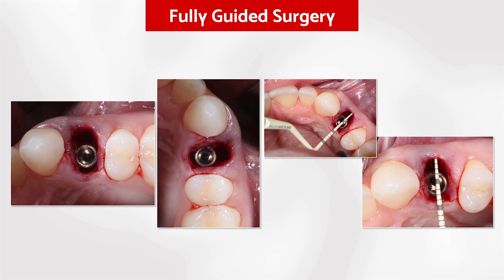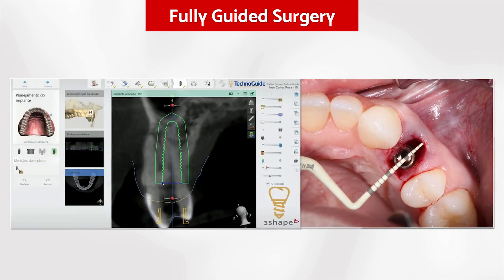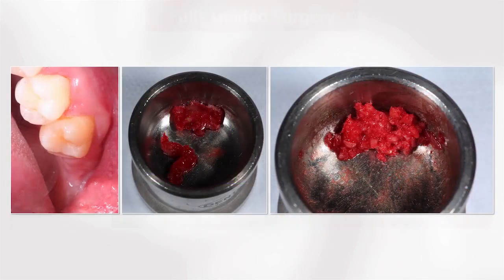Here you can see that the space between the external aspect of the implant and the inner part of the soft tissue was respected following our surgical planning. Here we were planning the gap at the buccal aspect. So the bone was taken from the left tuberosity.